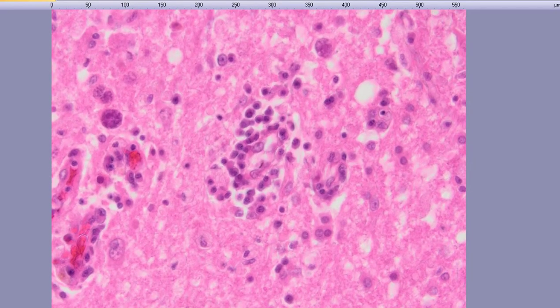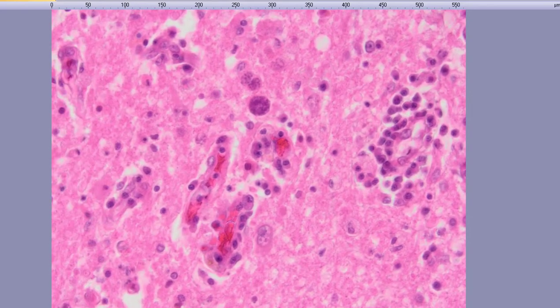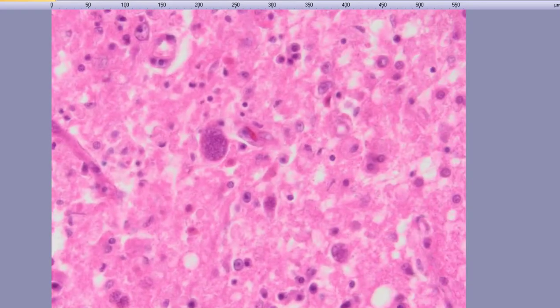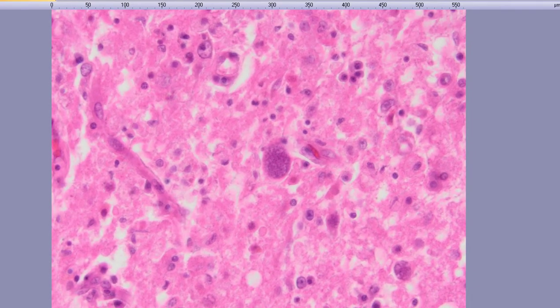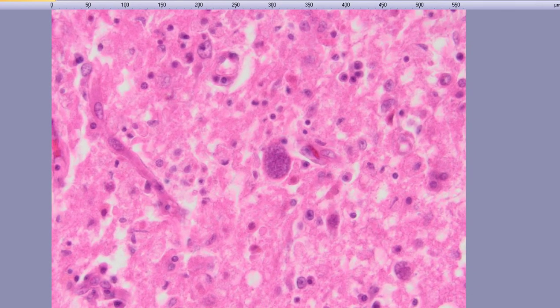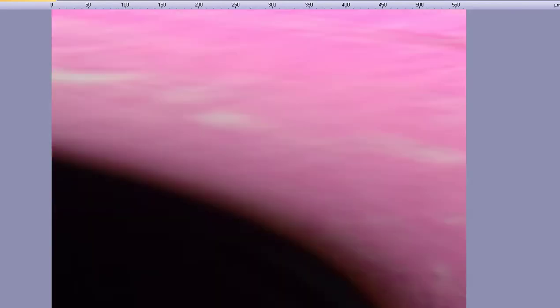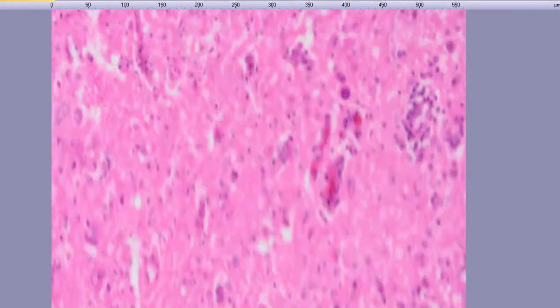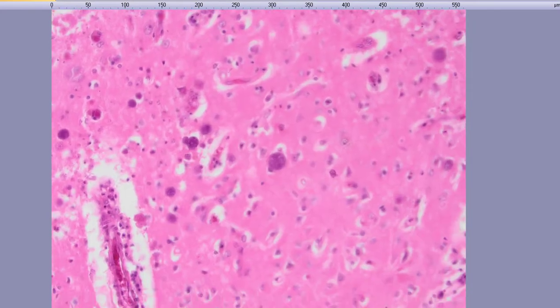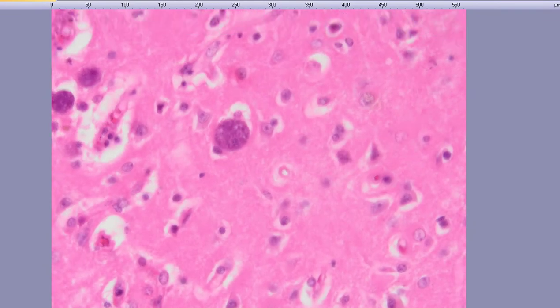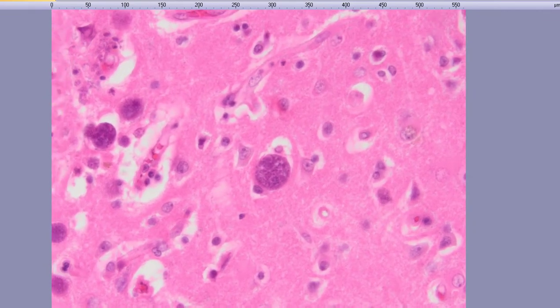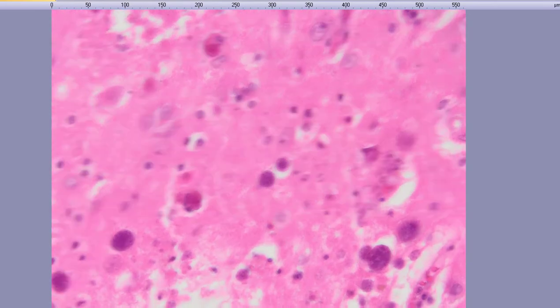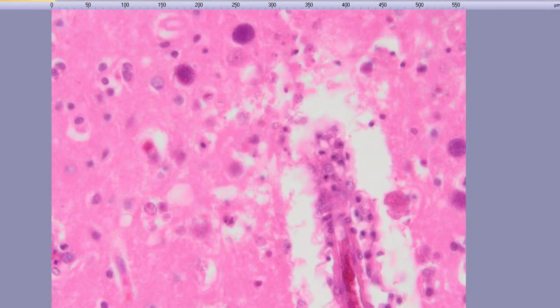These are the microglial nodules, perivascular microglial nodules, and you've got astrogliosis here and you've got these encystic bradyzoites. I'm going to show you the immunohistochemistry in a minute, which is going to prove to us that these actually are Toxoplasma gondii. So these are actually parasites, cystic bradyzoites within the brain tissue.